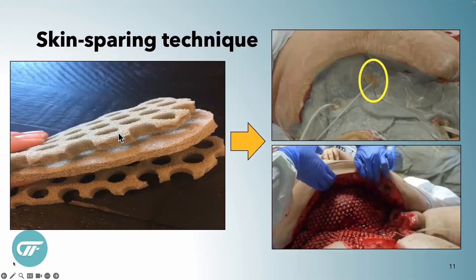What we do is take the waffle foam and put it on each side of one of the standard instill foams, then put it deep underneath the wall of the injury. This one is 20 centimeters deep, so we have the waffle foam on either side and the instill port is way up underneath the skin. If we put the instill port right on the surface, it's not going to reach way up underneath. We really want to make sure we're cleaning these wounds — especially necrotizing fasciitis — by having the instill getting all over the wound bed itself.